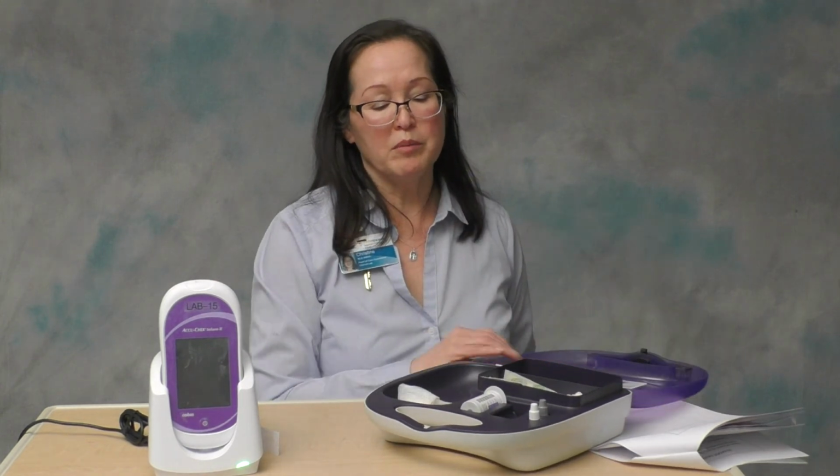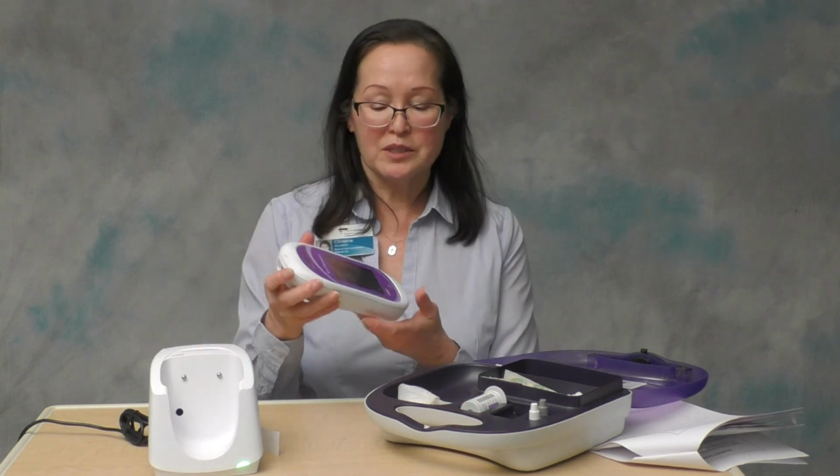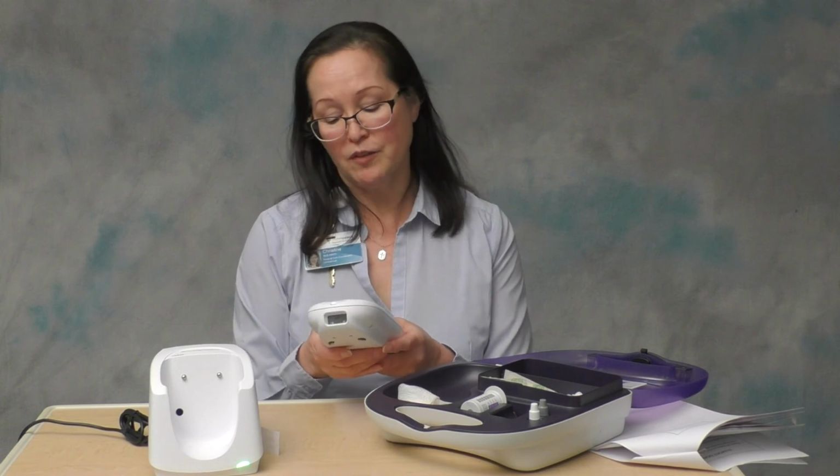First of all, I'm going to make sure that the patient does not have impaired peripheral circulation. So fingertips are pink and evenly pink. If they're pink and mottled, or if they're any color other than pink, that indicates some degree of impaired peripheral circulation. You're not going to do testing. So these fingertips are pink and evenly pink. So I'm going to say it's okay to do patient testing on this patient.